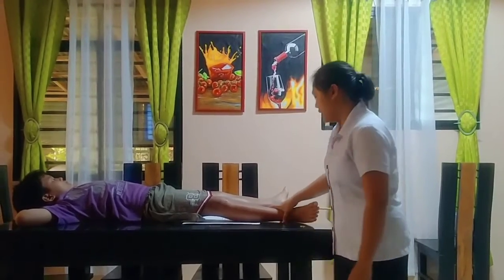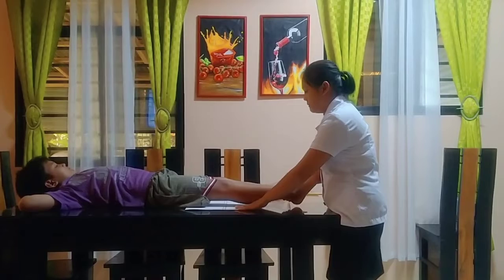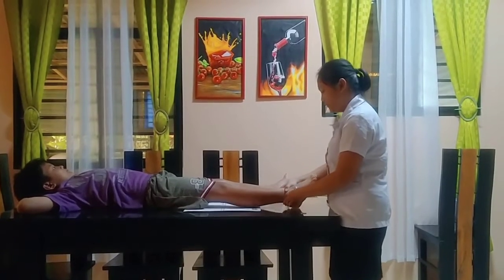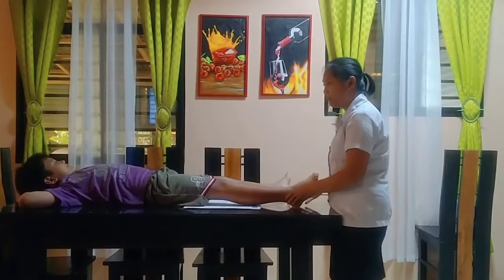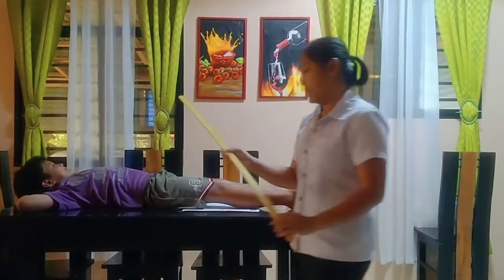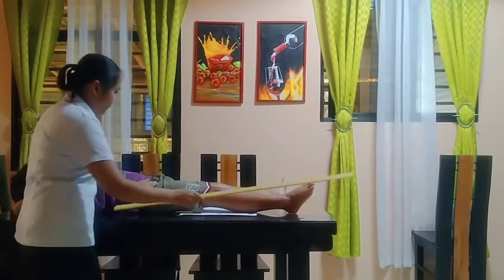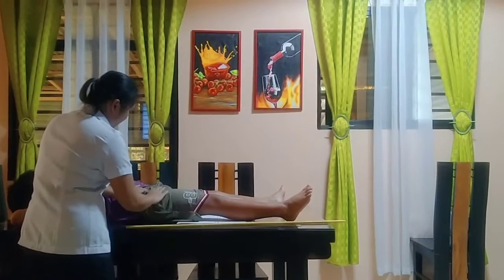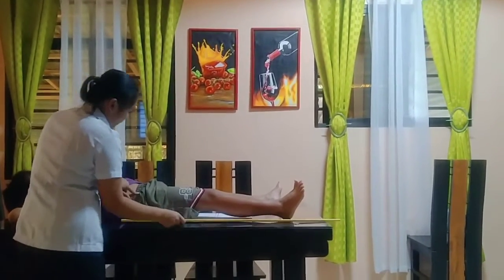Now, ensure po natin na naka-straight ang paa ng pasyente. Ayan. Hindi po gumagalaw. Now, we will be measuring the thickness of the patient's pelvis. So, kinakapa po natin yan. So, dito po.